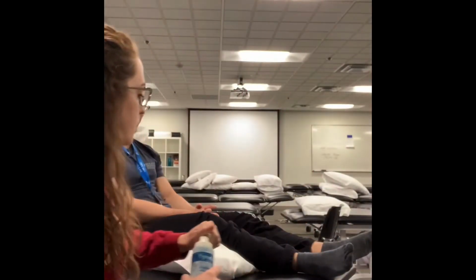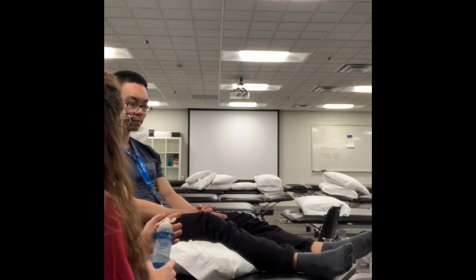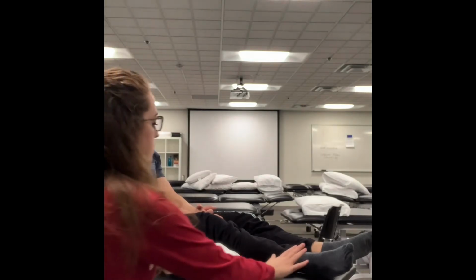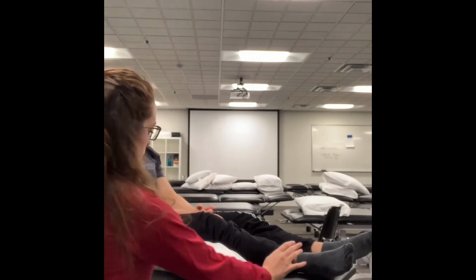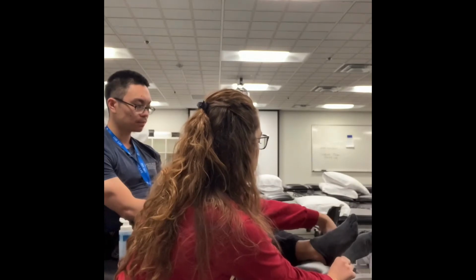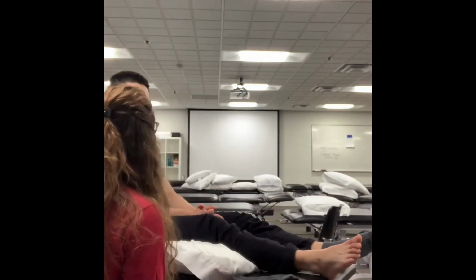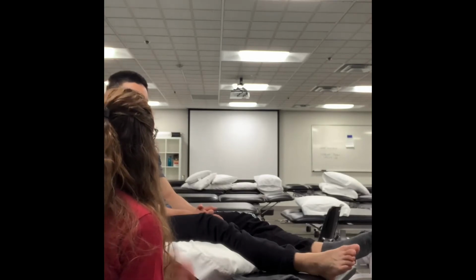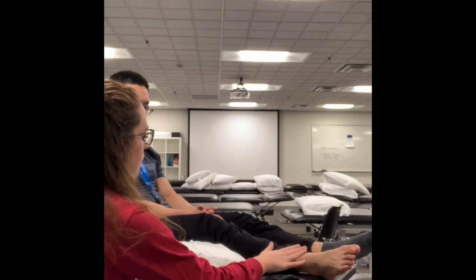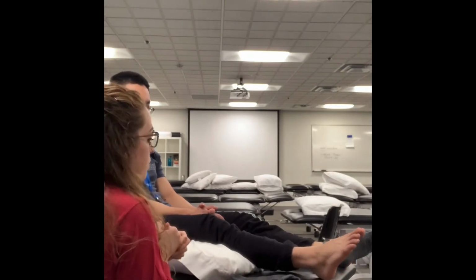All right, John. Do you have any questions for me before we start about ultrasound? No. Okay. So is it okay if I take your sock off? Sure. And then I also want to check your sensation on your ankle, since you have diabetes, correct? Yes. All right. Do you have sensation in your feet? Pretty sure it's all good.